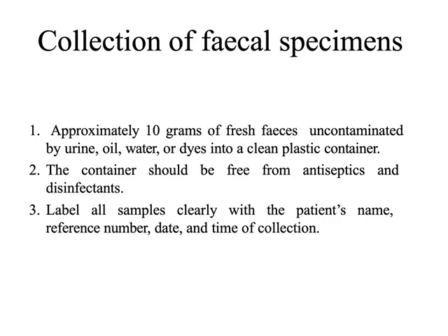We always go by procedure. So for example, first of all, let's talk about the collection of the fecal specimens. Approximately 10 grams of fresh feces, okay, we can take for the examination. It should be uncontaminated with urine, oil, water, or dyes. Okay, and we have to keep it in a clean plastic container. This container should be free from any antiseptics or disinfectants. And we have to label it.